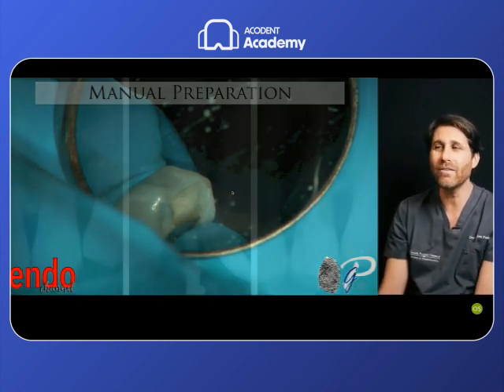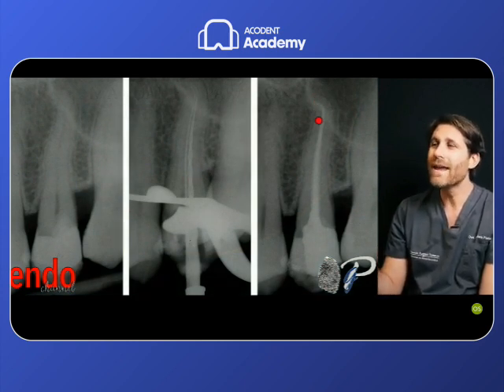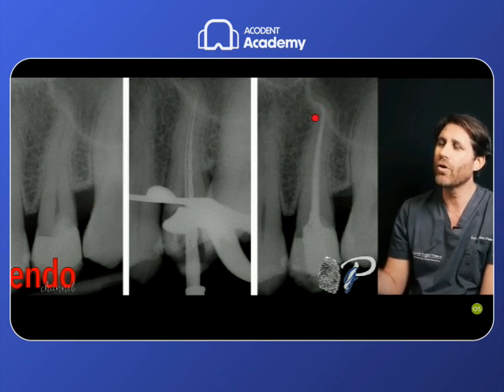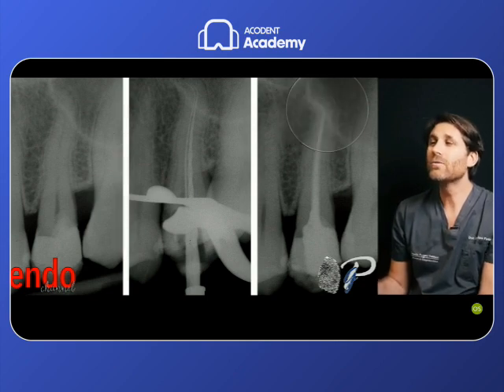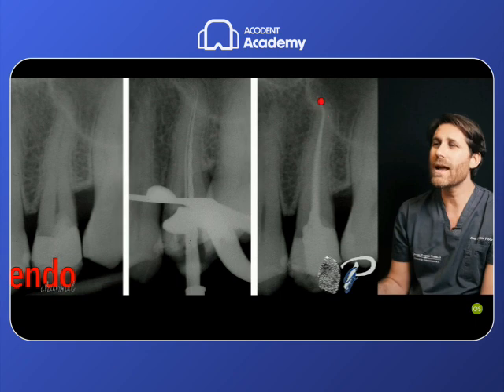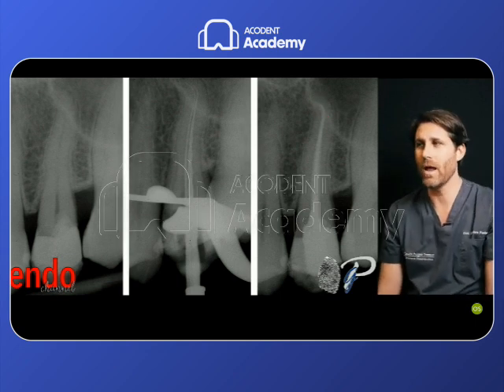But in this case, it has been used on purpose to make a deformation and a transformation of this apical curvature, not the foramen. This stainless steel file with the apical precurvature going over this apical difficulty is used with the intention to regularize this abrupt curvature, to regularize the abruptness of this curvature, to penetrate this curvature in a much easier way.